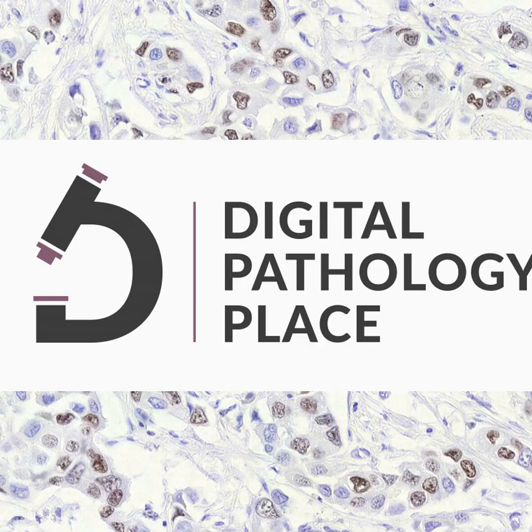Once you have a clear idea, for instance, what type of biomarkers can help you stratify a patient population in a larger clinical trial, I think that's a time where you should dial down, which could still be in IF, having fewer markers. For instance, we like to reduce the complexity, especially if you think of data mining afterwards. The more parameters you have, the more crowded your parameter space is, and the more complex the whole analysis becomes. So if you can make it simpler, you also have to deal with less noise. And then maybe it's even the best, because honestly, they're just more robust.